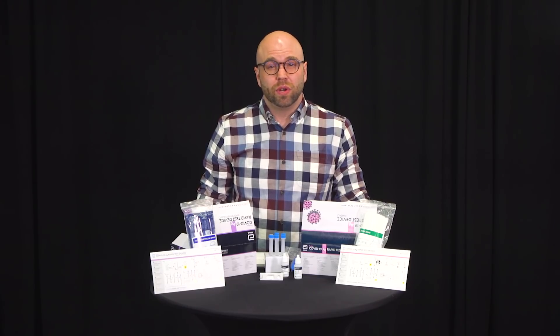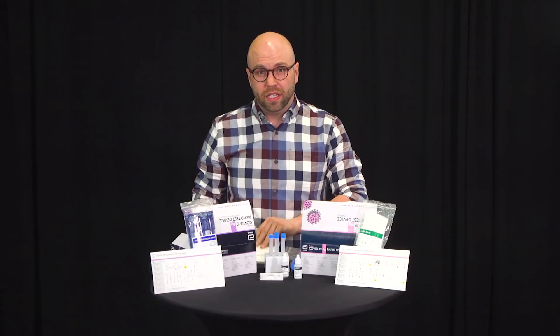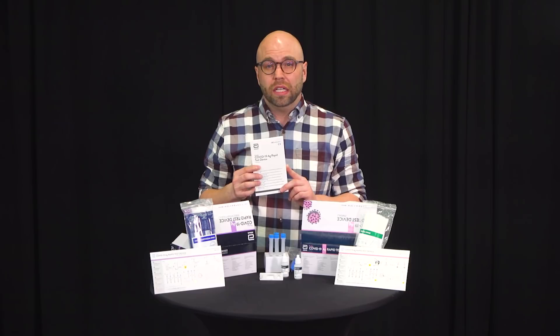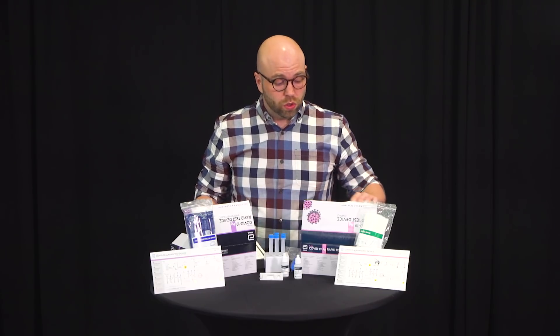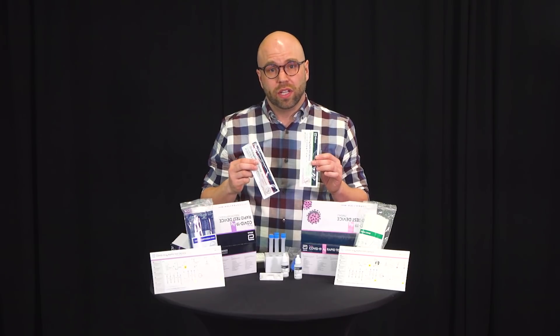The rapid test is a screening tool and not a full PCR test. When you receive your kit of 25, you'll also receive a manual. Please read the manual so that you know exactly what type of test you are performing. You'll also notice that there are two control swabs in the box.